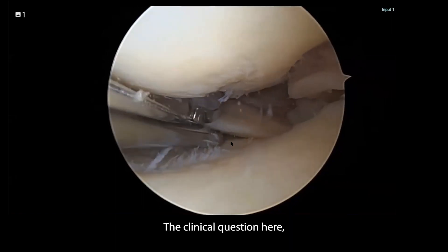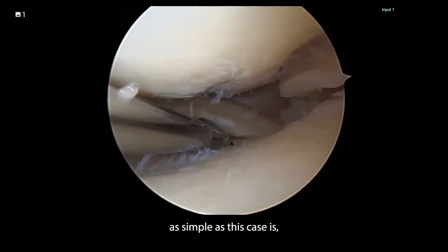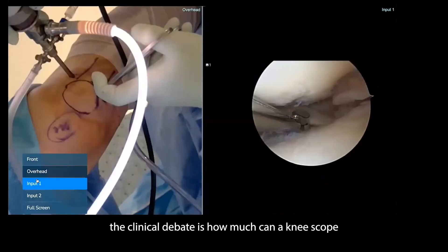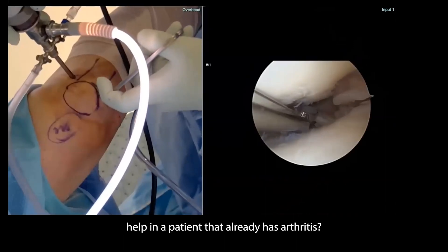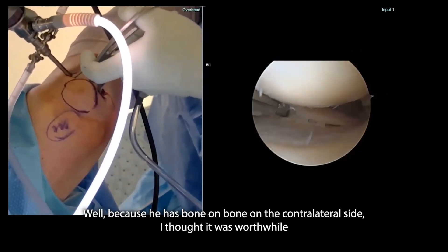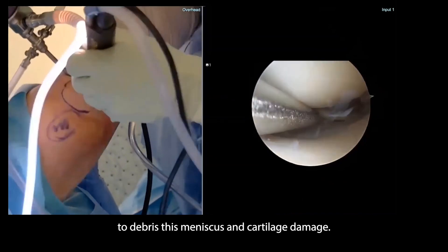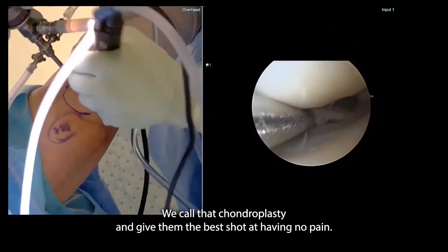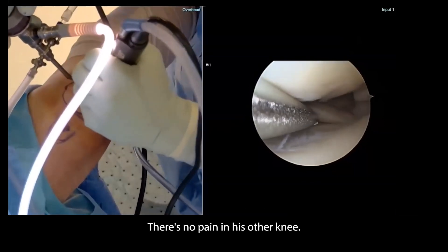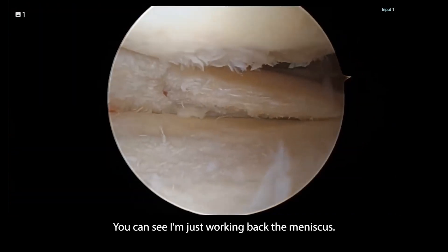The clinical debate, as simple as this case is: how much can a knee scope help a patient who already has arthritis? Because he has bone on bone on the contralateral side, I thought it was worthwhile to debride his meniscus and smooth out the cartilage damage — we call that chondroplasty — and give him the best shot. He actually has no pain in his other knee despite the x-rays showing bone on bone.